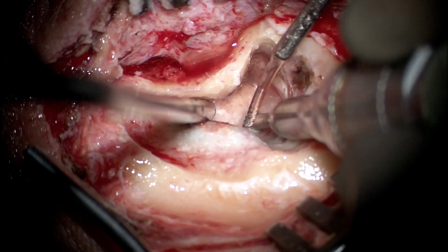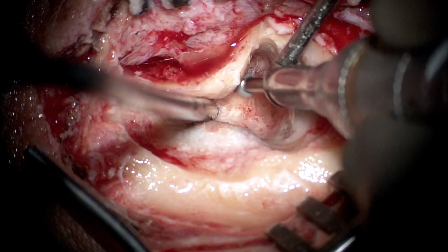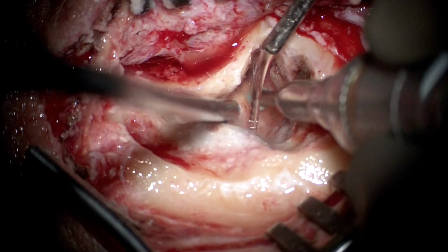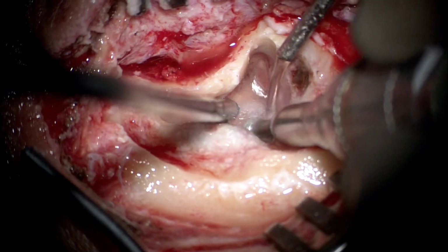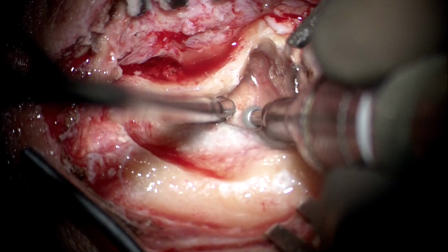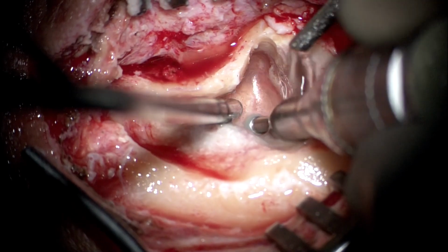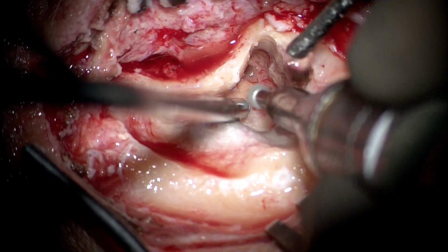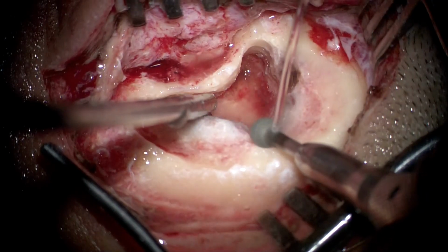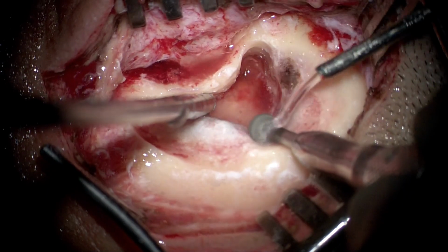In this situation, we have just exposed some bone behind the sigmoid sinus, that is the retrosinus bone, as well as inferior to the sigmoid sinus, to be able to gather a posterior trajectory into the labyrinth. However, since we are not planning to go translabyrinthine into the internal auditory canal or to the posterior fossa dura, we can stop short here. If that were so, then we would have to decompress a lot more bone, expose the retrosinus dura as well, and that is when we would be able to achieve a maximal amount of sinus decompression.